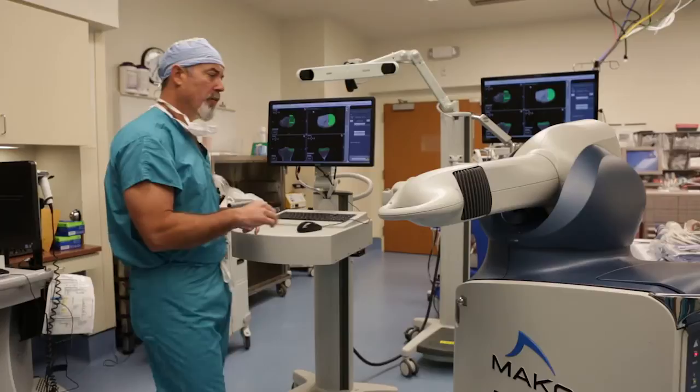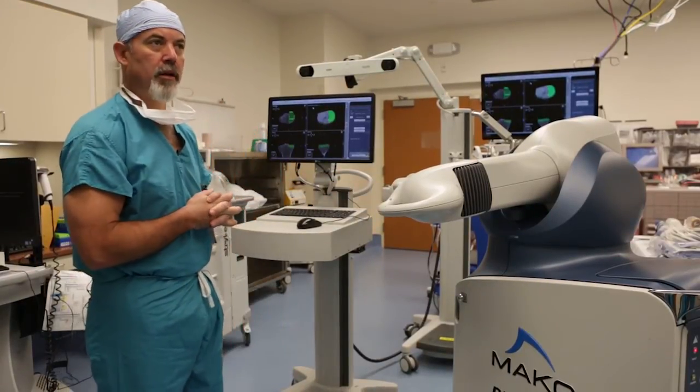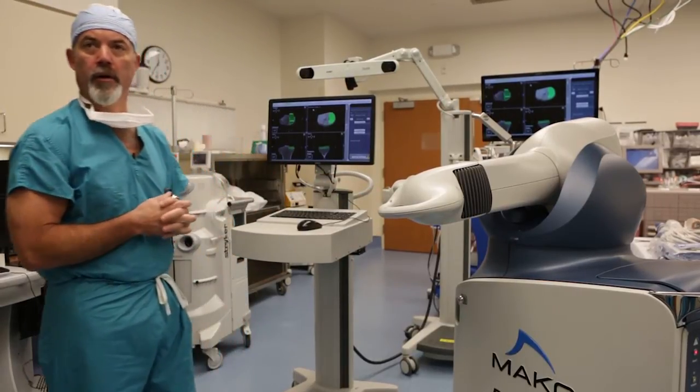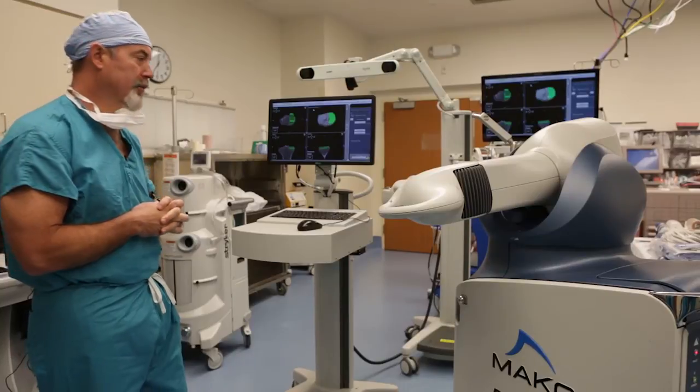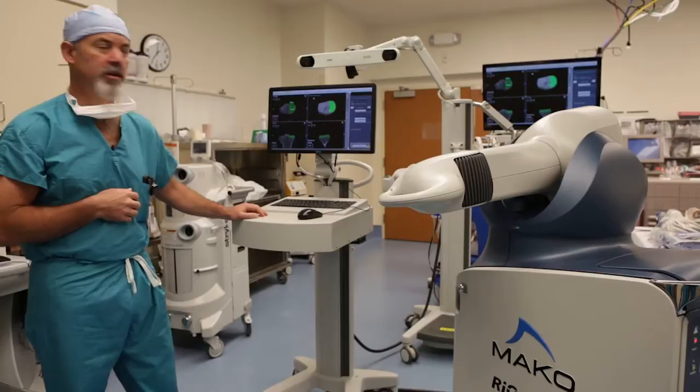This robotic arm has different end effectors. For partial knee replacement it's a six millimeter ball burr, and for total hip replacement it's a standard appearing reamer. Soon to come, we're going to have total knee replacement capabilities with this, probably within the next six to nine months or so.